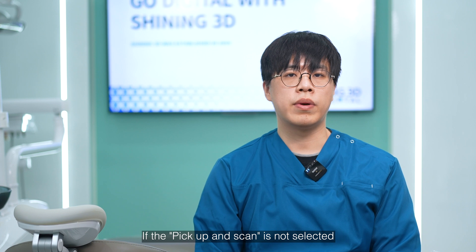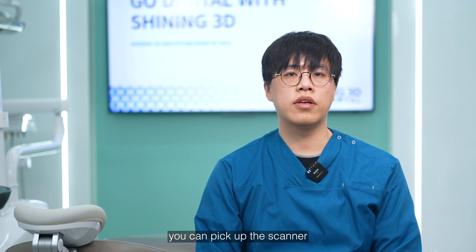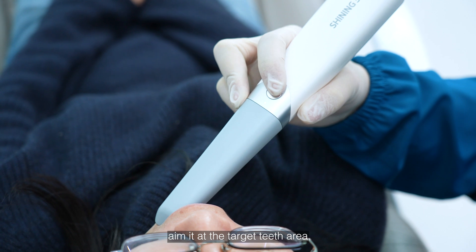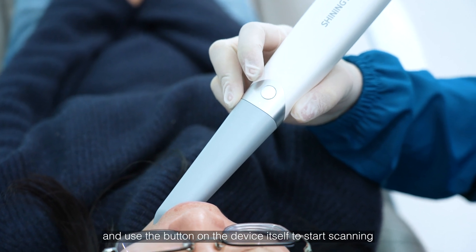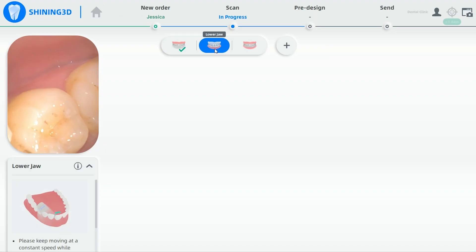Option 2: if Pick up and Scan is not selected, you can pick up the scanner, aim at the target teeth area, and use the button on the device itself to start scanning.